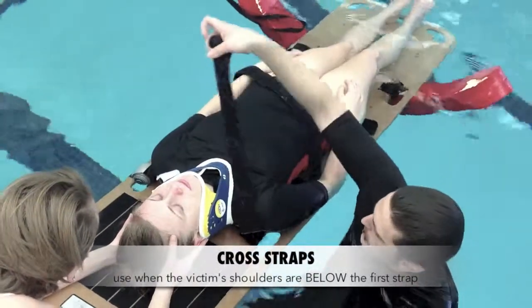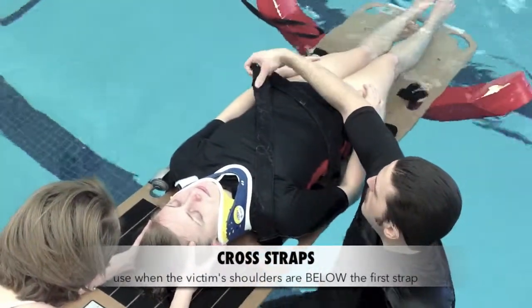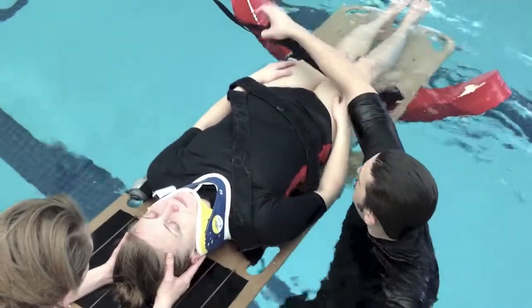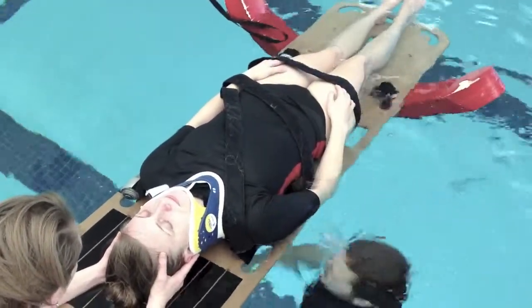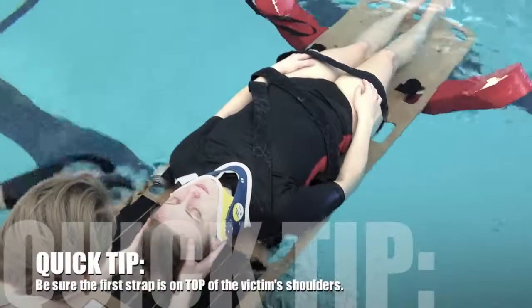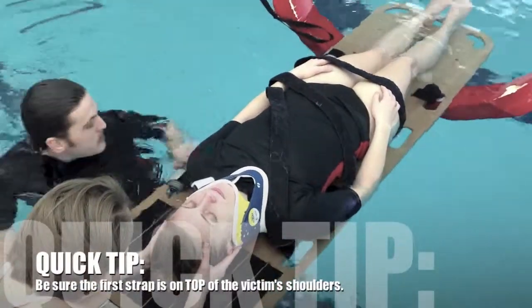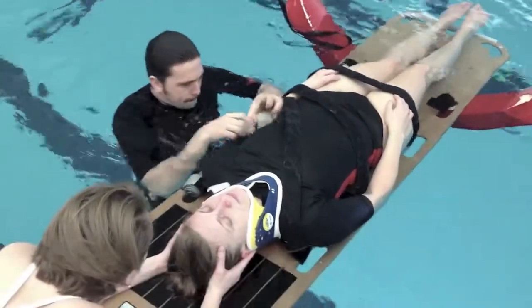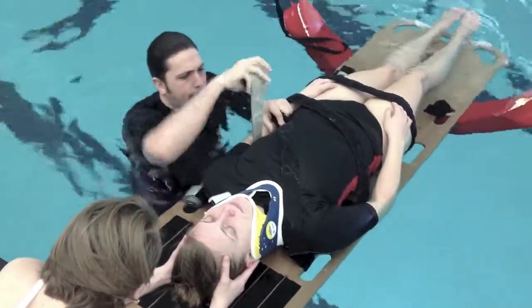If the victim is too low on the board, you can use the cross strap technique. To do this, you will put the first strap over the victim's shoulders and across their chest. Use the second strap under the victim's arms and tightly Velcro to the first strap on the opposite side to create an X across the victim's chest. After you Velcro each strap, be sure to double check and assure that they are tight.